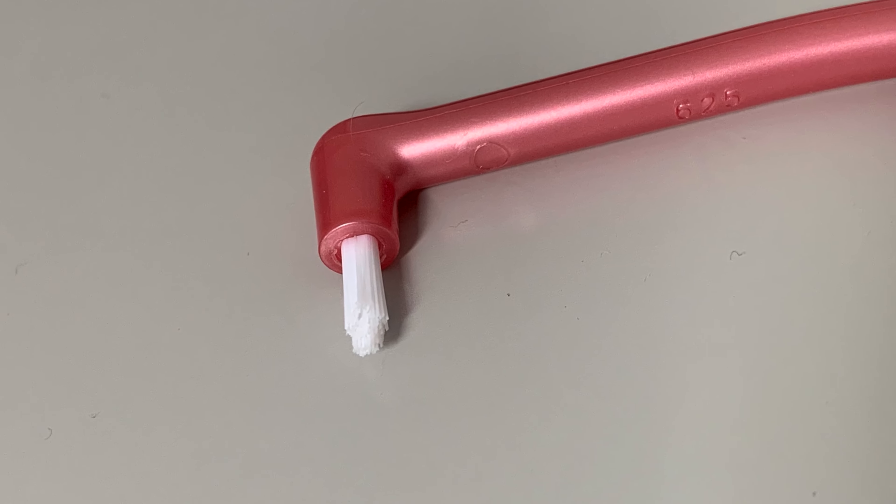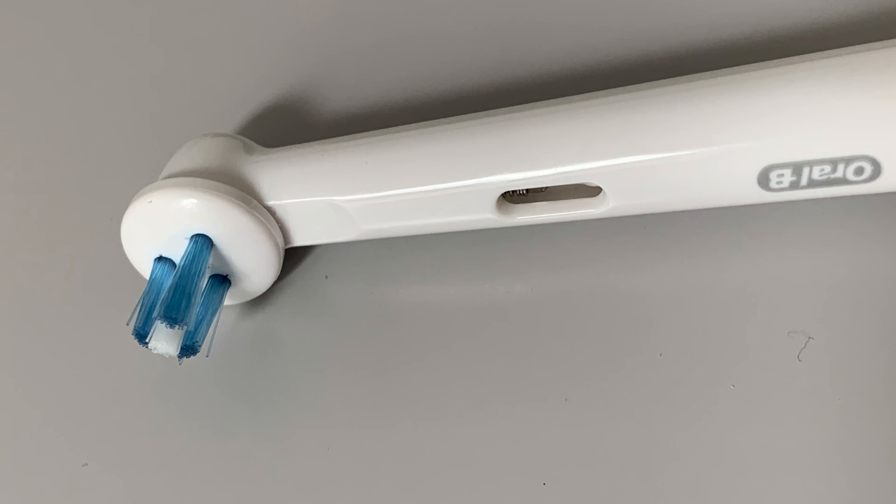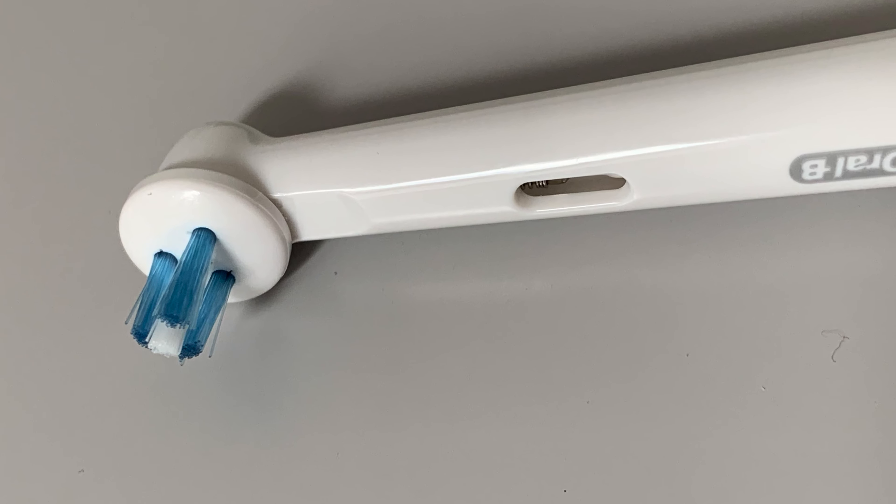This video is about interspace brushes, sometimes called single tufted brushes. This is an interspace brush, and this is an interspace brush attachment on an electric toothbrush. These are designed, from the name, to clean the spaces in between the teeth. However, we don't recommend they're used for that purpose — we'd rather use an interdental brush like this that passes all the way through the gap right in between the teeth for better cleaning.